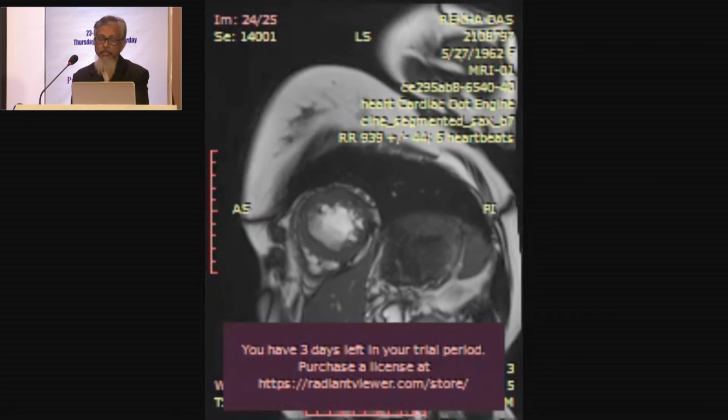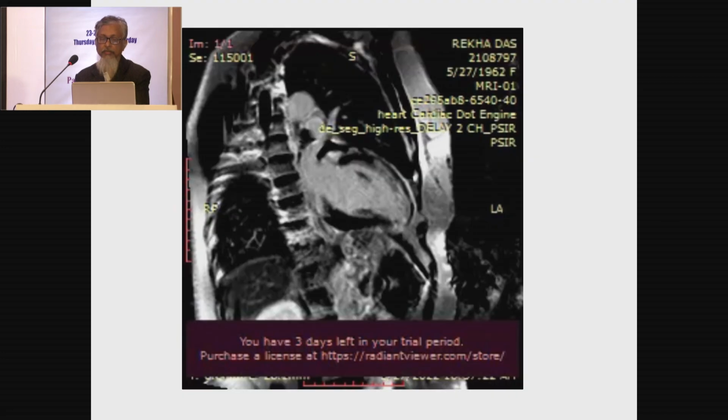So it was not akinetic as we found in the dobutamine stress echo. But as we moved on in late gadolinium scanning, you can see this is the normal thickness of the normal myocardium. If you compare this with the scar tissue here, you can find that more than 50%, about 70% scar tissue was there in that patient. So had this patient not had thrombus in the LAD on the first instance when she underwent coronary angiogram, she would have had a PCI done. So please remember, when you are dealing with a patient with old myocardial infarction, please look at the portion of the viable myocardium.